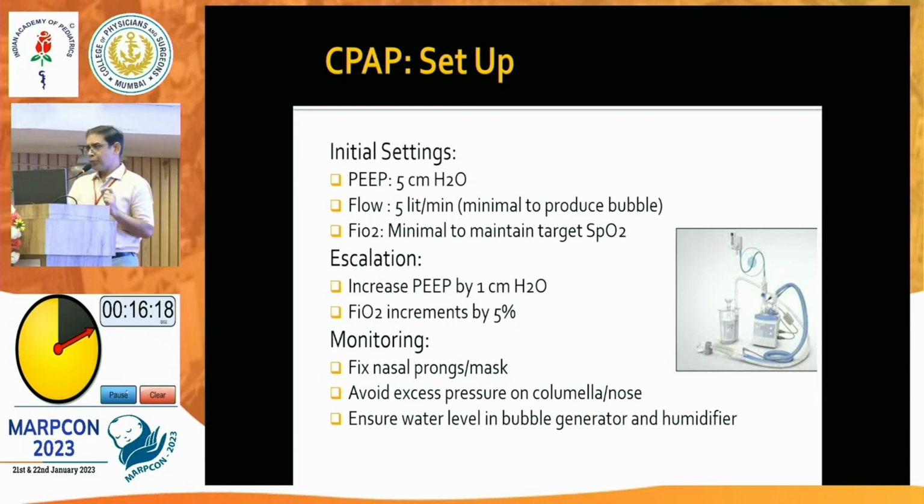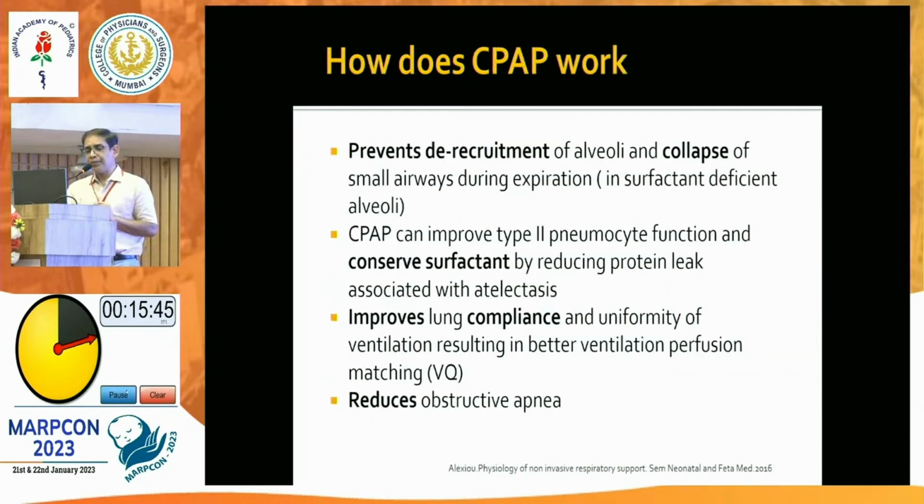Monitoring is the most important and tedious job while the baby is on CPAP. We have to make sure that the nasal prongs and mask are properly fitting. Otherwise, there will be sealing issues and leakage, and there won't be any good pressure generated. We also have to avoid excess pressure on the nasal columella, or if you are using a mask, make sure that there is not much excess pressure on the nose. We also have to ensure that there is an adequate water level in the bubble generator and humidifier.